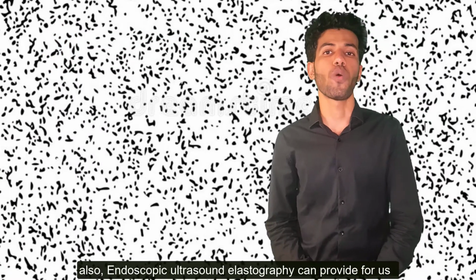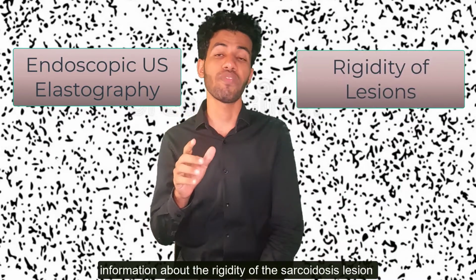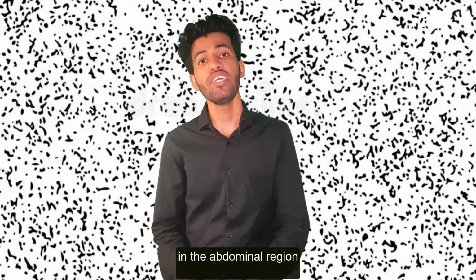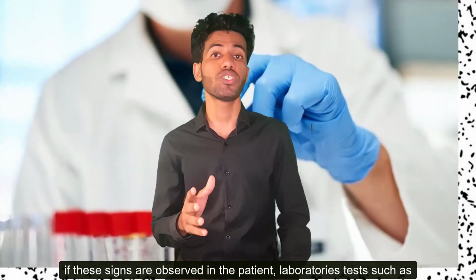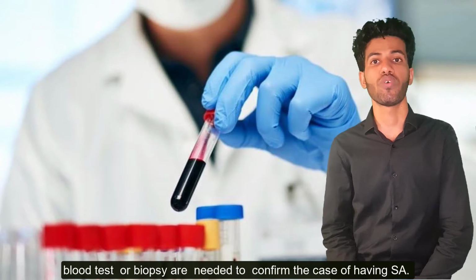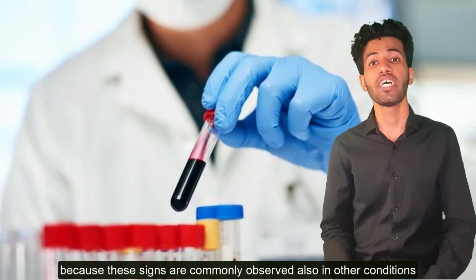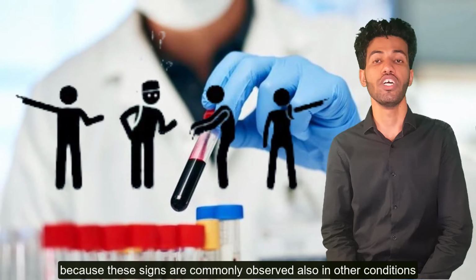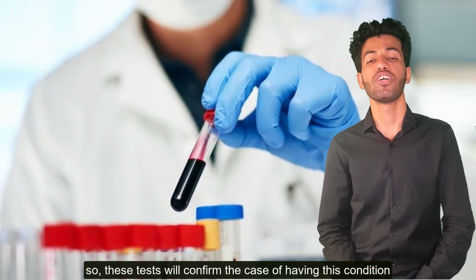Also, endoscopic ultrasound elastography can provide information about the rigidity of the sarcoidosis region in the abdomen. If these signs are observed in the patient, laboratory tests such as a blood test or biopsy are needed to confirm the case of having this condition, sarcoidosis, because these signs are commonly observed also in other conditions. So these tests will confirm the case of having this condition.